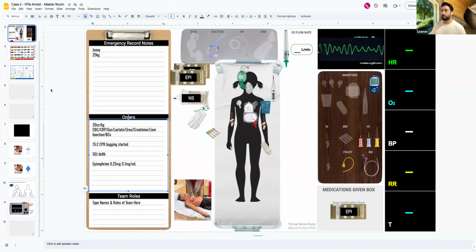So 2 minutes are up at this point. Okay, perfect. I'm going to go back to my defib machine. Okay, so off the chest, can we please check the pulse? Do we have a pulse? No pulse. Okay. If you can continue compressions, we're going to defib at 100 joules, so 4 joules per kilo. Okay, we'll charge. Charge.